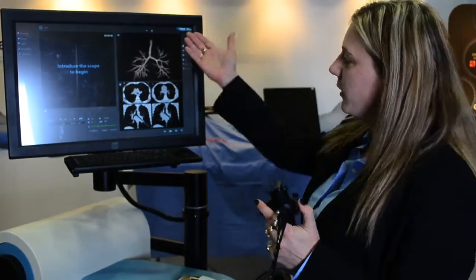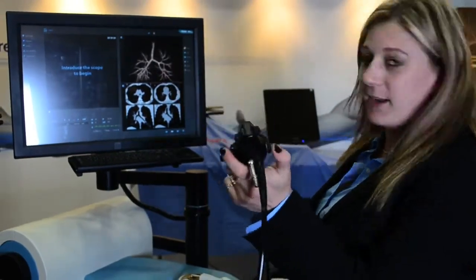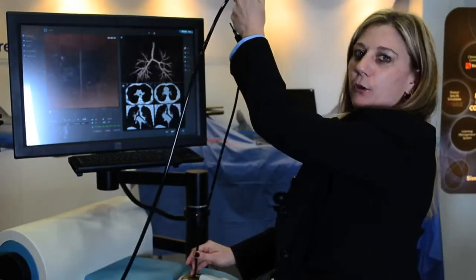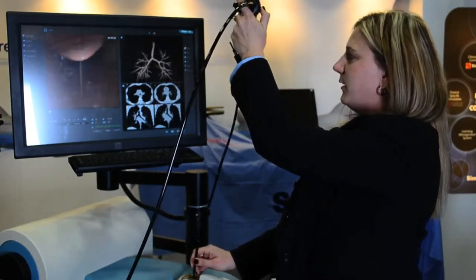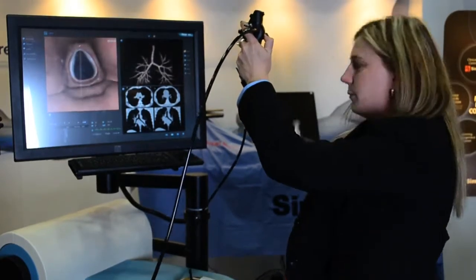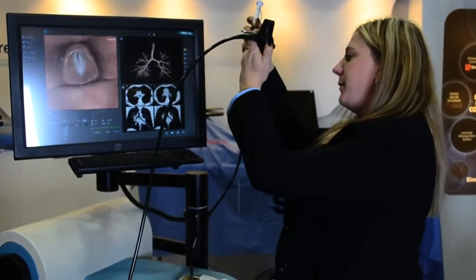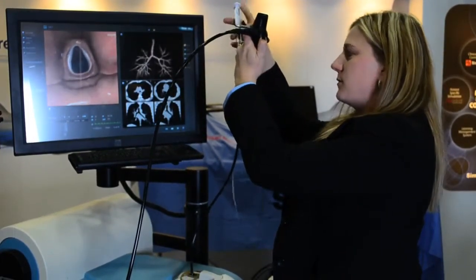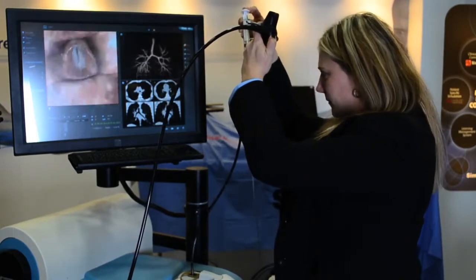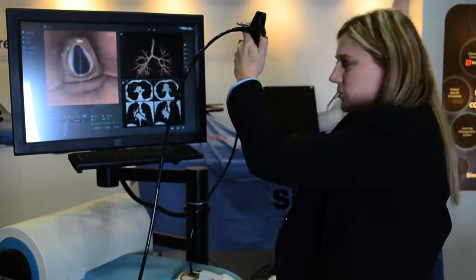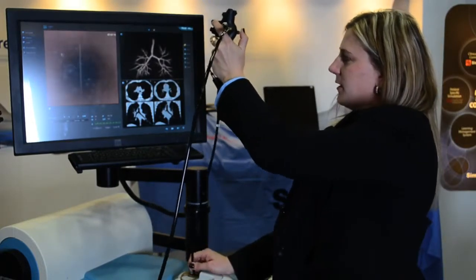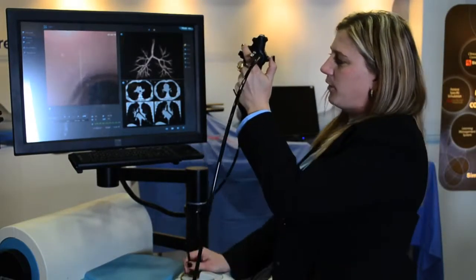So here we are with our bronchoscopy case. I'm going to go ahead and insert the scope — you can go in through the nose or the mouth. And here you can spray lidocaine, just to relax the patient.